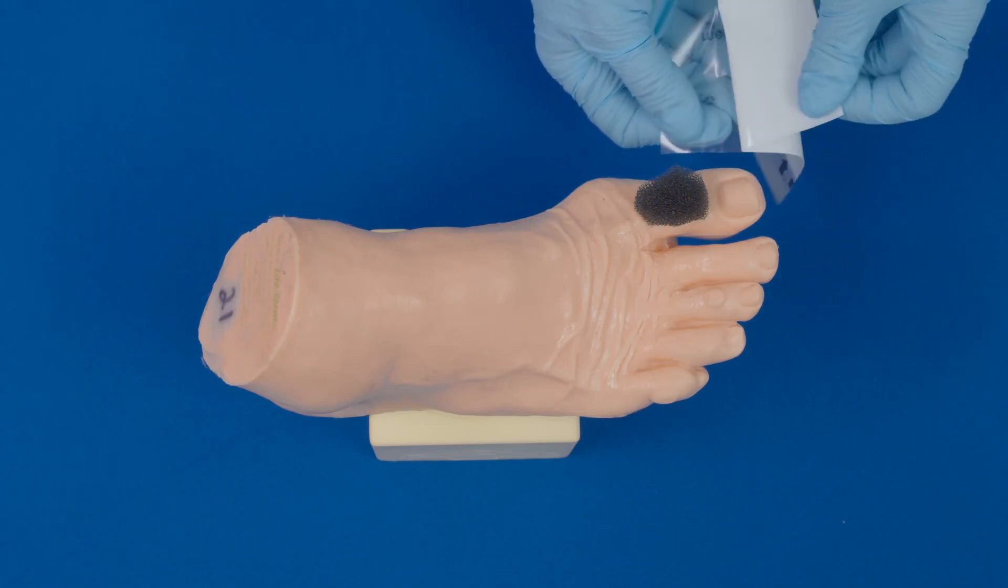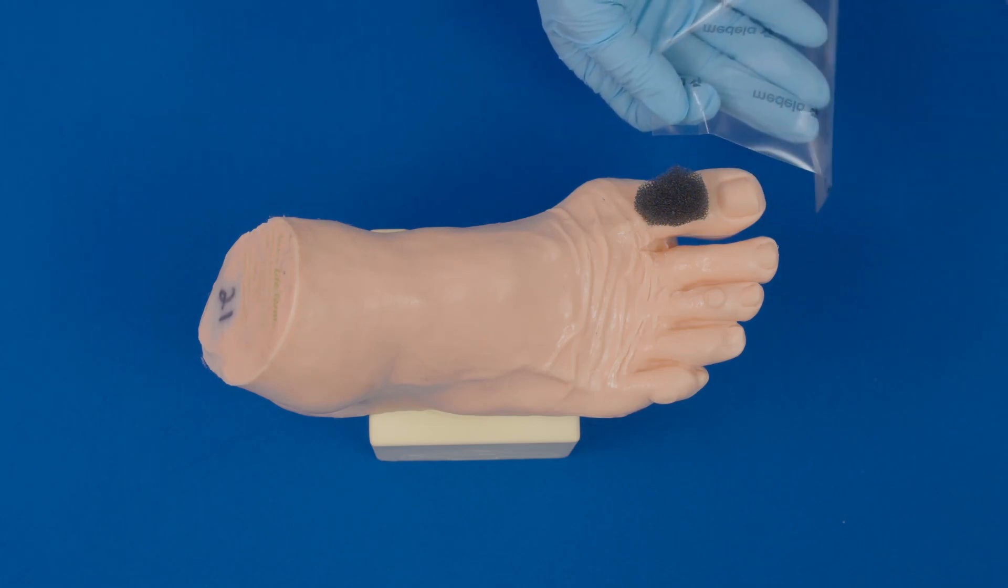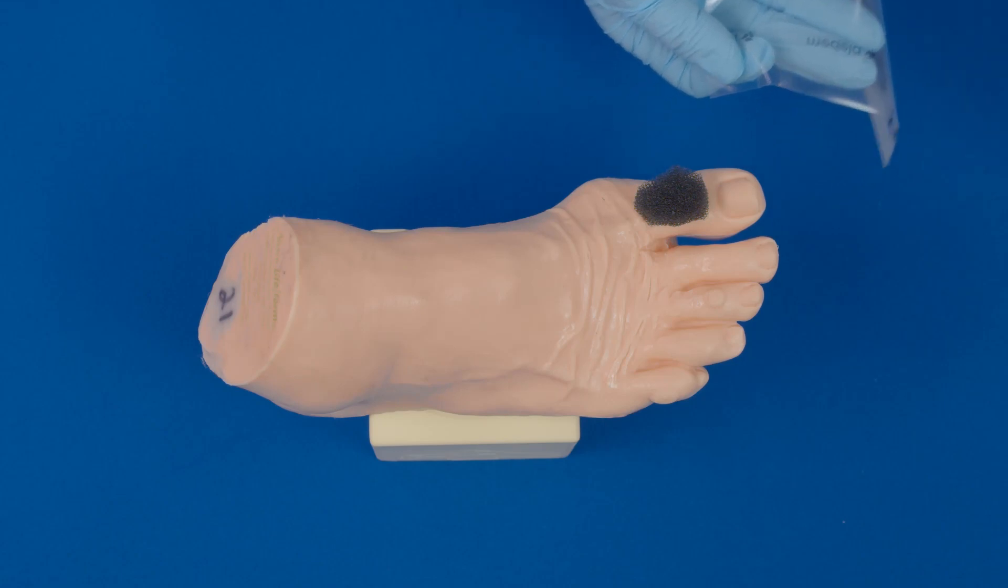The sandwich technique describes sandwiching the wound and surrounding toes in between two pieces of transparent film.